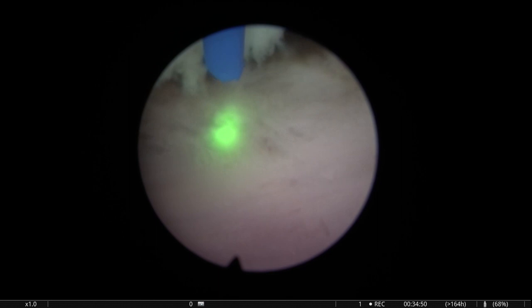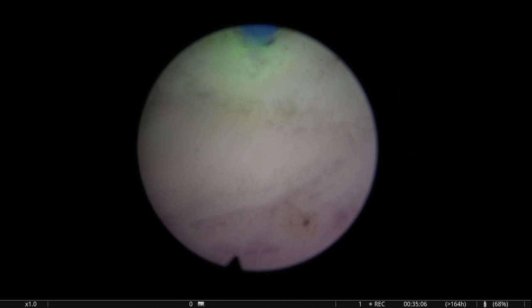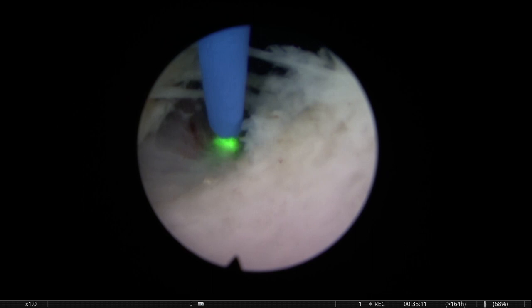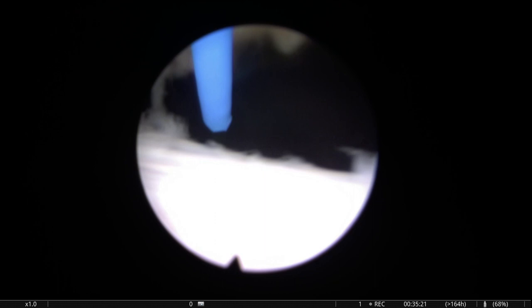So this is the end of the operation, just cutting the 6 o'clock attachment. Here, sometimes if I feel it's more comfortable, I lost my way a little bit. But if you feel that it is more comfortable, I would turn my fiber to 6 o'clock. Sometimes it's okay like that. But there it is. That's the end of the enucleation phase.